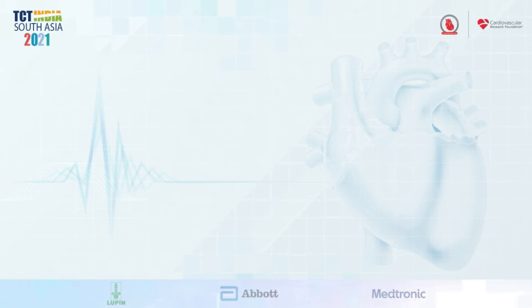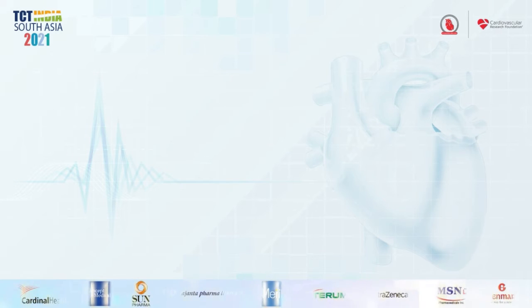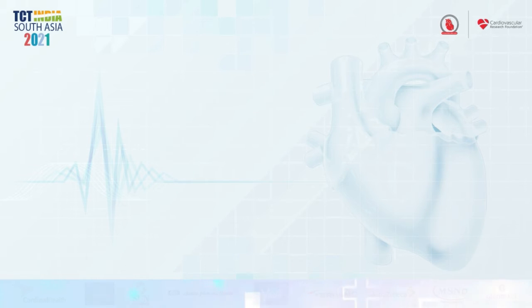He was advised physiological assessment of the ostial left main, but because that was a STEMI-like situation, the operator avoided it. He came here, and you can see the ostial left main in various projections. Here I did an FFR. Very importantly, when you do an FFR, the equalization has to be done in the aorta. The FFR came out significantly positive at 0.74.